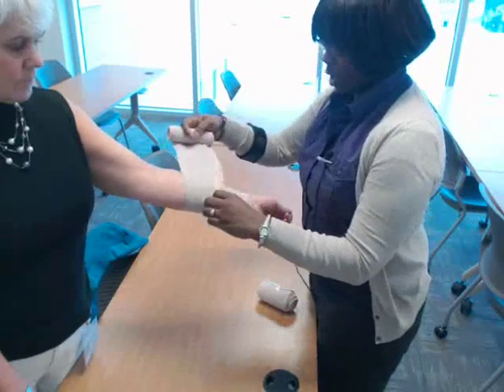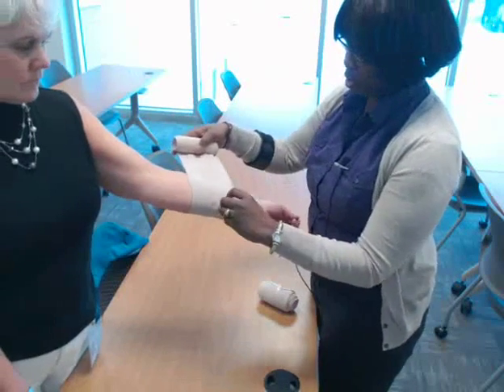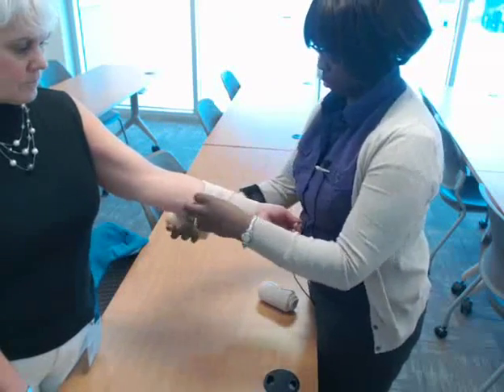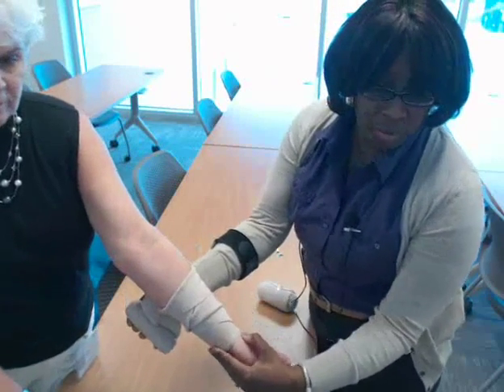What the reverse spiral gives you is a lot more support for your patient to help prevent edema. You can see that criss-cross pattern with the reverse spiral.